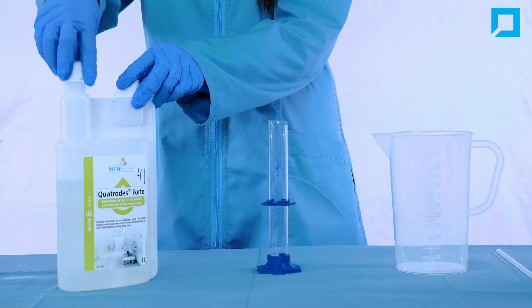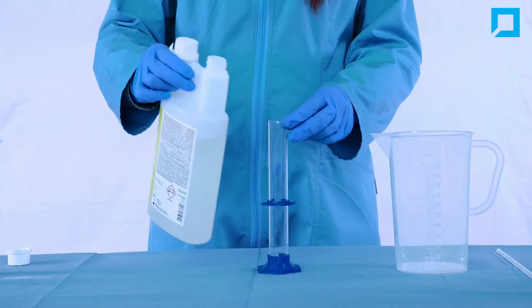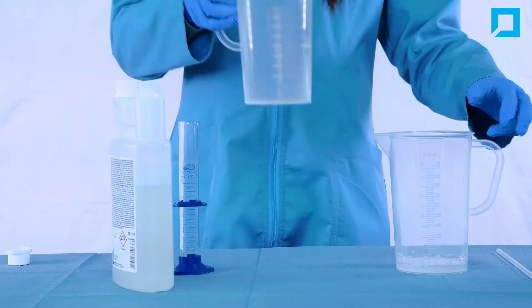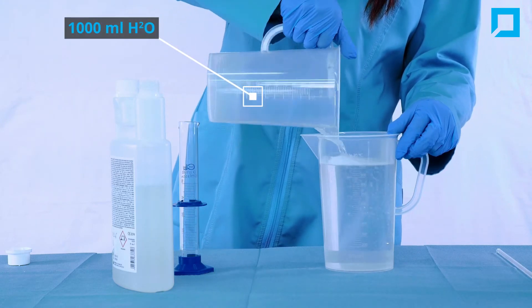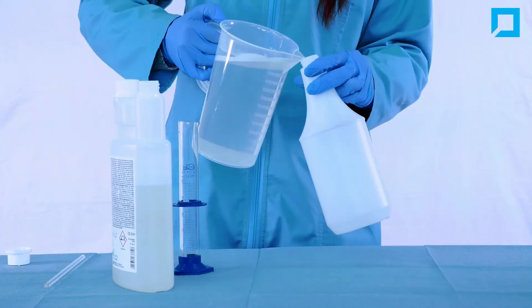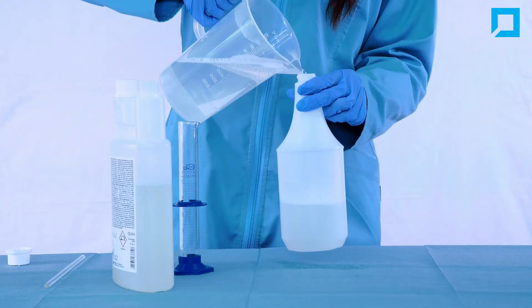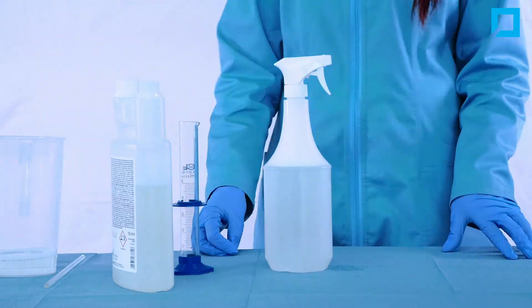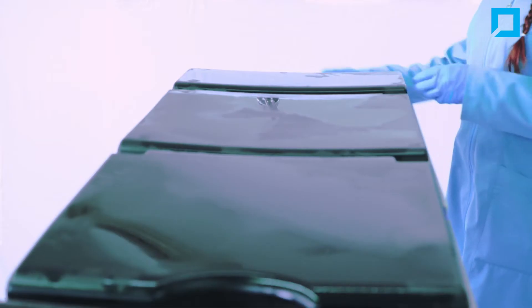Prepare a mixture of washing and disinfecting liquid according to the manufacturer's instructions. Use the prepared mixture to disinfect the mattresses. Remove the mattresses and repeat the procedure for the other side.